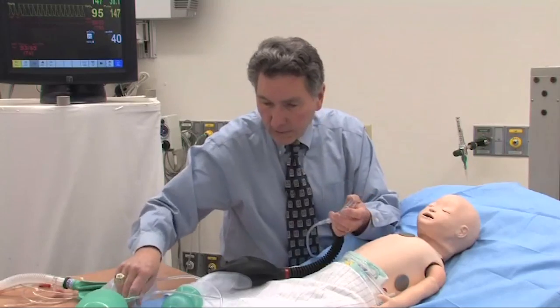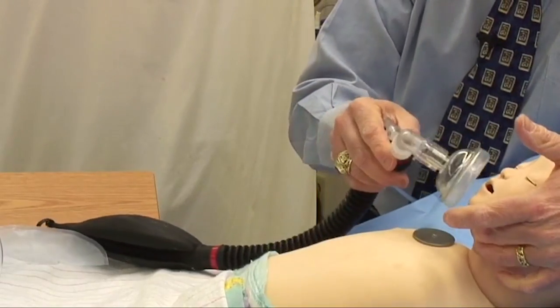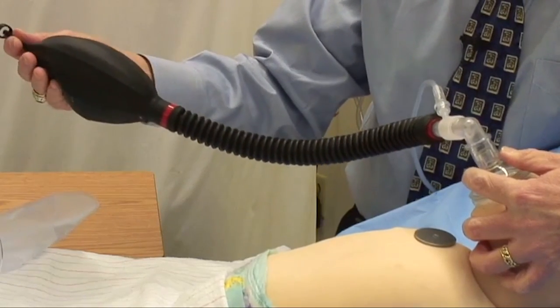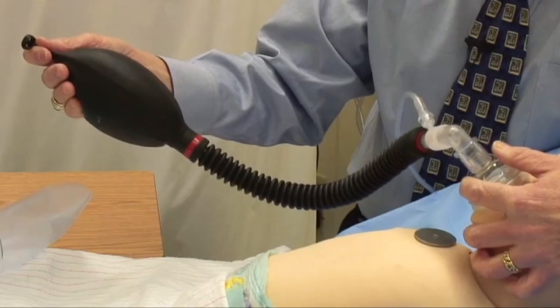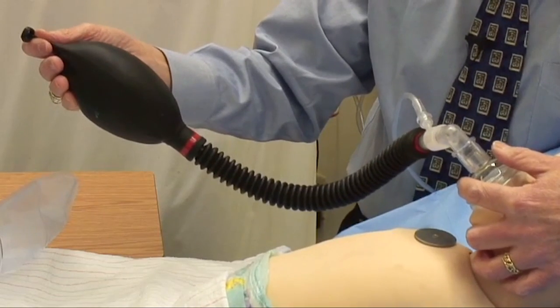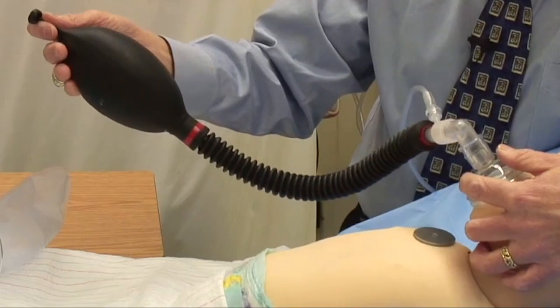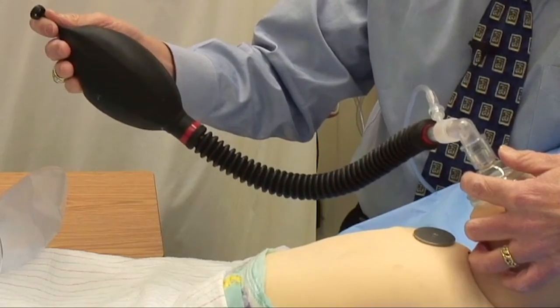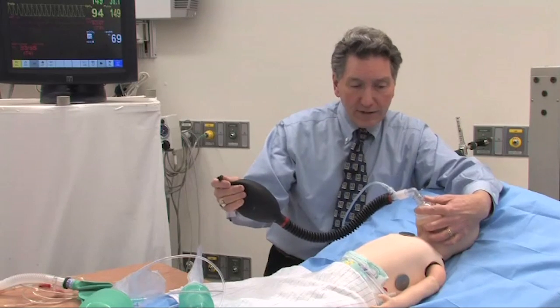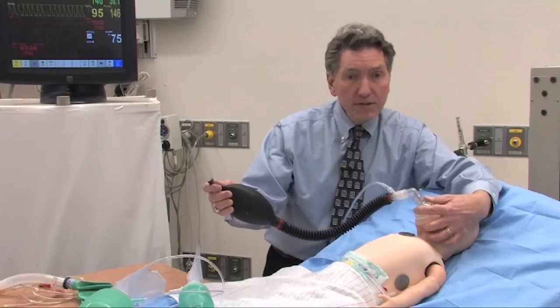On the baby, I'll tend to choose a smaller mask, come around, and get a good mask seal with my fingers on the valve. If the baby's breathing spontaneously, I can let them go ahead and watch the bag going up and down. If they're having a little difficulty, I can generate some positive pressure and CPAP. If the baby really isn't breathing adequately, I can fully ventilate the patient using this system. Again, it's a seamless transition back and forth between spontaneous ventilation and mechanical ventilation — something you really can't do very well with the self-inflating bag.